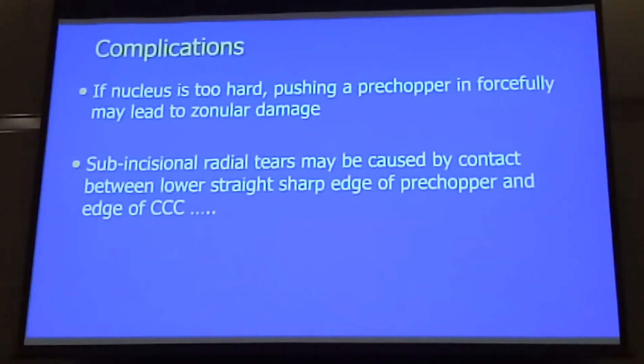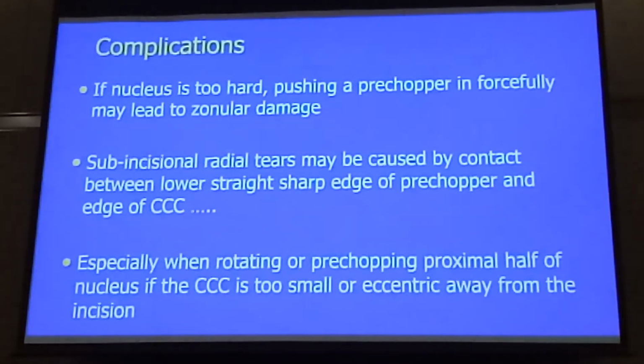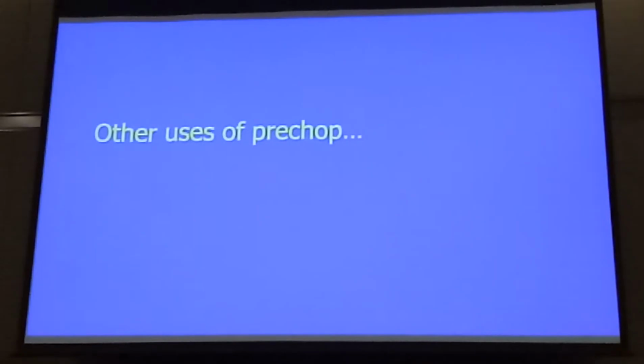But you have to be aware of complications. If you are trying to do a 3 to 4+ nucleus and you use the combo 2, because you forgot what I've said, and you push into it, what's going to happen? You're going to break zonules, aren't you? So when you start, choose those soft, 1+ nuclei. Those are very, very good. And as I've said, sub-incisional radial tears may be caused if you're not careful, especially when rotating or pre-chopping the proximal half of the nucleus.